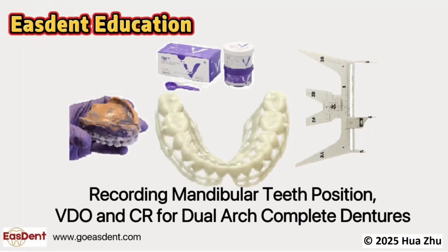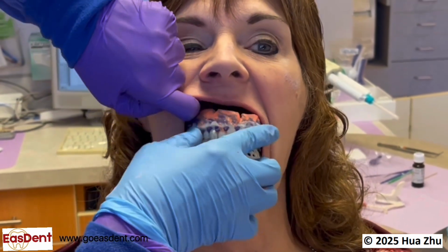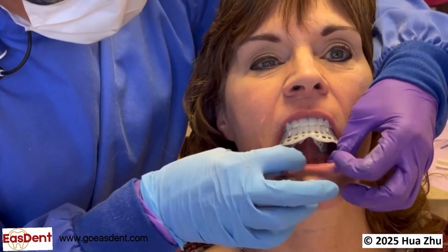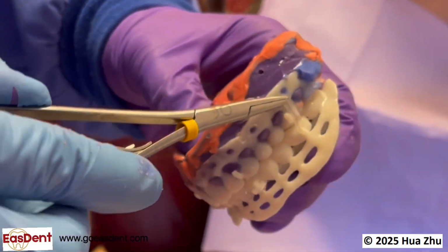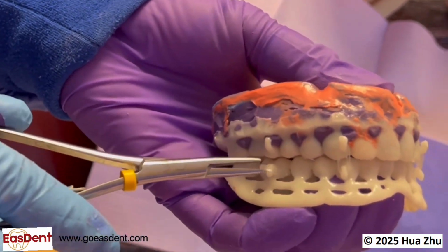Use putty PVS impression material with mandibular eastern tray to collect the teeth position, centric relation, and the VDO information. If the patient can open wide enough to allow both maxillary impression and mandibular trays to be inserted together, secure the maxillary eastern impression to the mandibular eastern tray using elastomers.